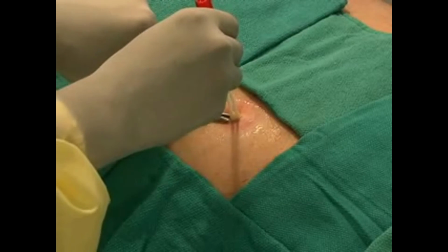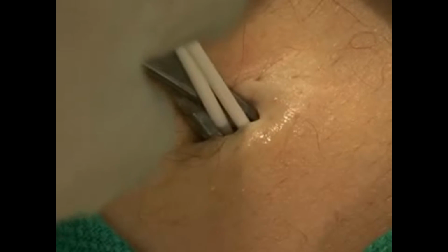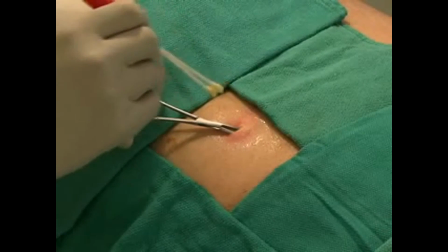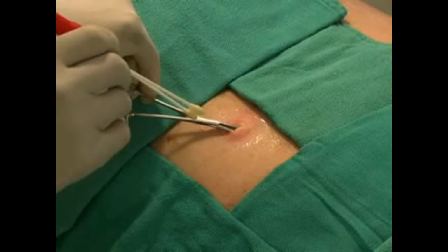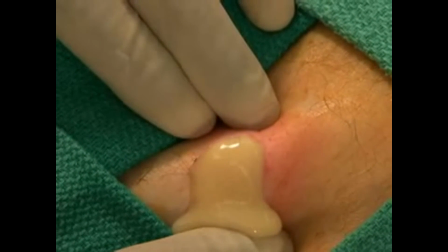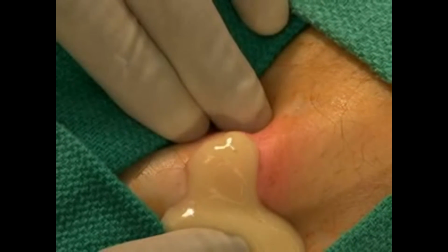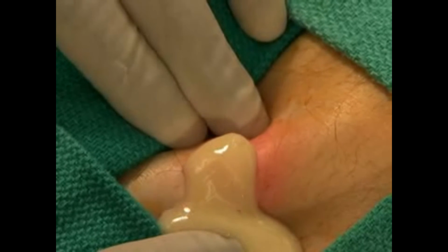While most patients will not require antibiotics after an abscess drainage, culture information is useful if the patient's condition later worsens and antibiotic treatment becomes necessary. After allowing the wound to drain spontaneously, gently express any further contents. Additional injections of local anesthetic may be helpful during this portion of the procedure if there is significant patient discomfort.